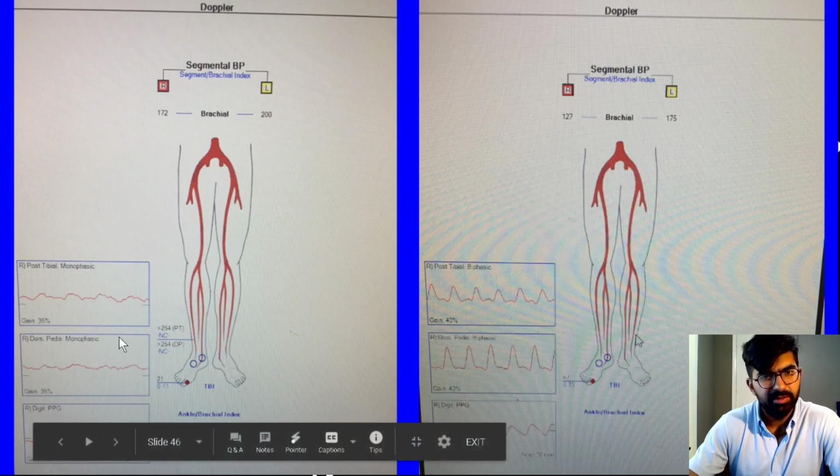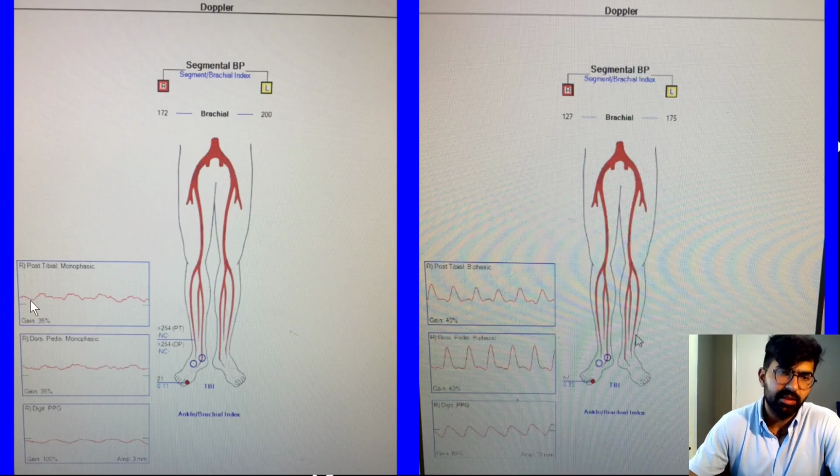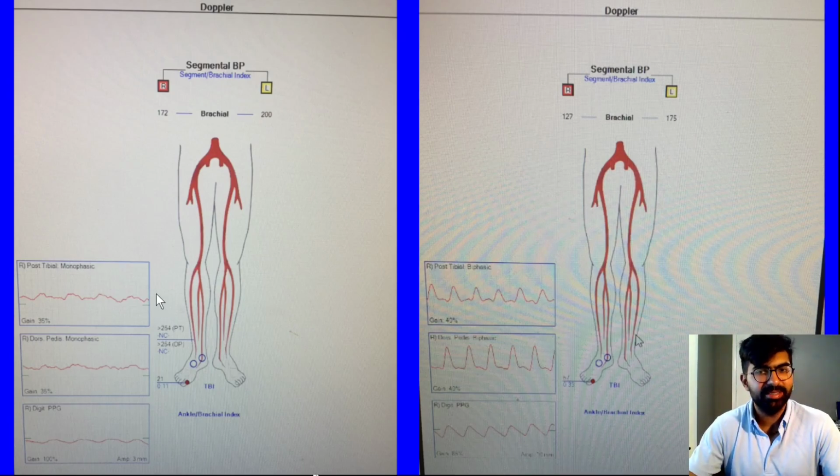Though it's a very distal waveform, you do see that even after the left to right femoral bypass, you notice a significant increase and changes in waveform. Again, the lower amplitude, increased time to peak, all points to an inflow lesion, which again was fixed with the femoral bypass. But this is a great example of how it's really fun and interesting to look at how these waveforms change, especially before and after revascularization. Do they make sense? Is there a reason that he still doesn't have true reversal of flow here?